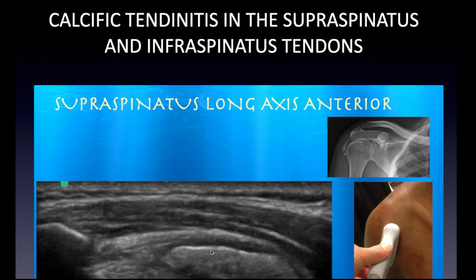So I think, once you aspirate all this calcium, in my mind, there's a defect in the rotator cuff now, right? Instead of being filled by tendon, you almost have a hole in the tendon. Now, I tell patients though, I'm not causing that hole. All we're doing is trying to evacuate the calcium out of your tendon, but you do have a defect in this tendon even before the procedure. You don't want patients thinking you caused that defect. That wouldn't look good for you.